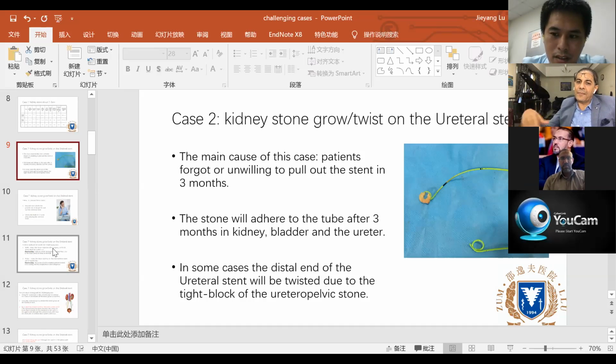But the management, as you mentioned, has multiple choices: either combine PCNL with cystoscopy, with ureteroscopy, based on where the main bulk of the stone is and which is the easiest way to fragment the stone and pull out the rest of the double J. I think Dr. Tariq highlighted an important point. If we have a lot of cases in our region, why not collect these cases, document them, and make a nice publication from that?